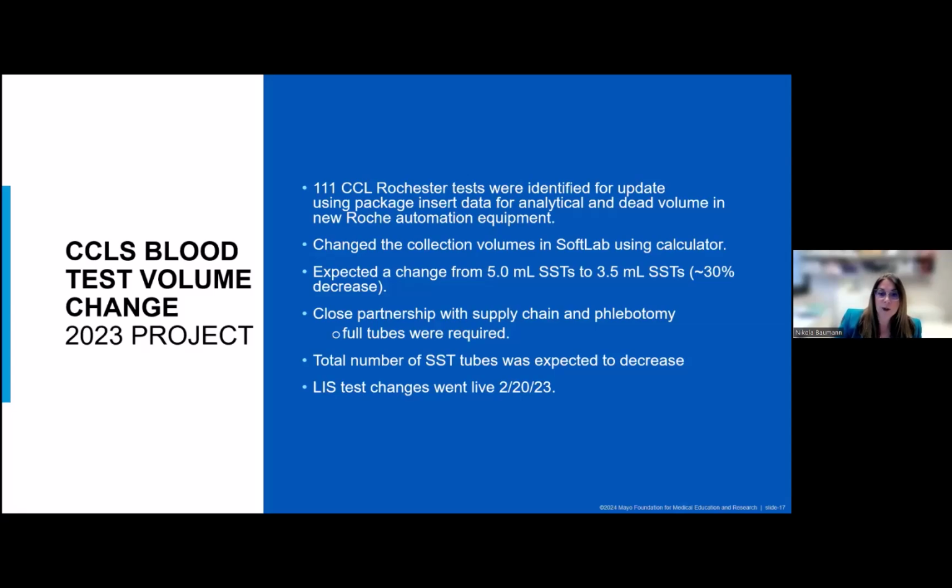But even lithium heparin tubes, if they are underfilled, there are many studies talking about changes in lab parameters. LD can increase by up to 30%, potassium up to 25%. So again, full tubes, best practice. It's how these tubes were designed to be used. You're going to reduce hemolysis. We know for coags, the one that's obvious to us, because we reject them when they're less than 90% full. But even potassium EDTA, if those collection tubes are underfilled, you will see significant differences in CBC parameters. And again, there are several papers in the literature reporting this. So having a policy in your lab for how full tubes must be is, I think, really a good practice and something that we can discuss further afterwards if people are interested.